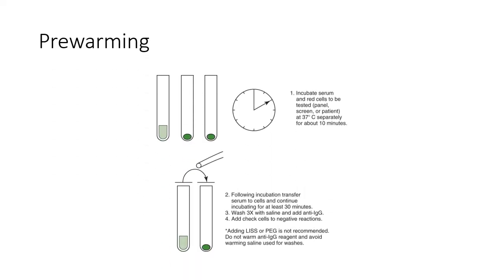This is a schematic of what it looks like. Now, notice in this schematic, it says you do it for 10 minutes. That's going to be something that's based on wherever you work, right? But 10 minutes, 15 minutes, okay, both of those are technically correct. Following the incubation, transfer serum to cells, and continue incubating for 30 minutes.